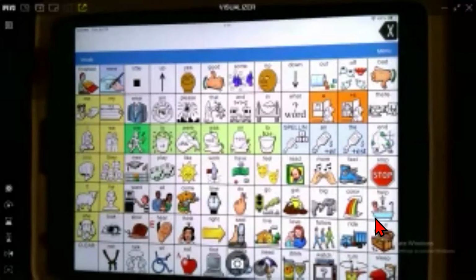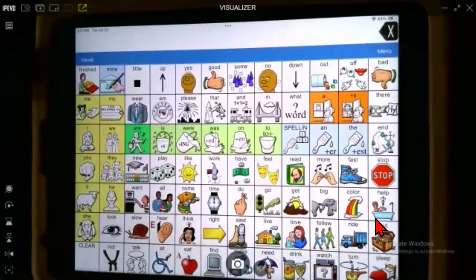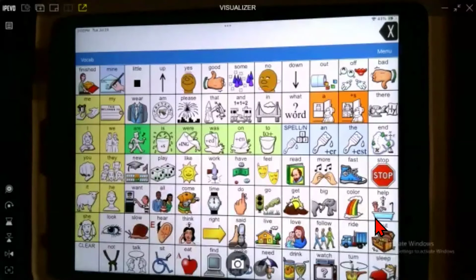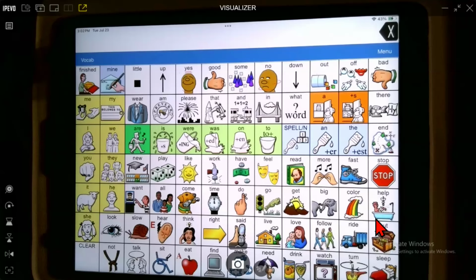Thanks, Stephanie. I'm really excited to get to teach this. I realize that some of you are going to be brand new, and others really know a lot about using Words for Life and have been implementing it with individuals for years. So I have to start out really basic, and then keep going forward and get more complicated as we move along. That kind of guarantees that either you're going to be bored at the beginning or overwhelmed at the end. So the good news is everybody will hate the training before it's over. But I'm just going to jump right in.